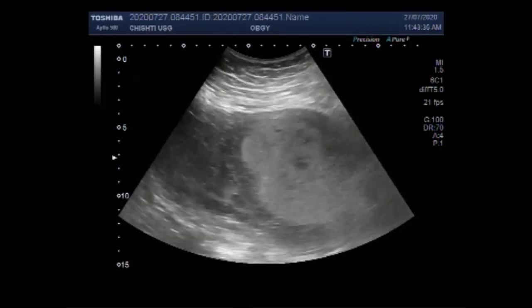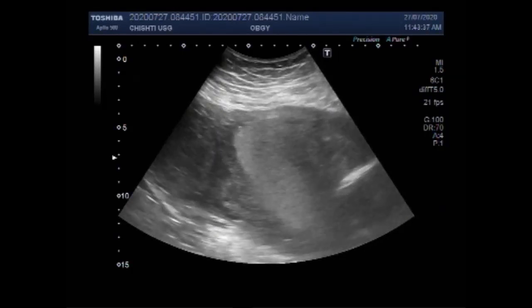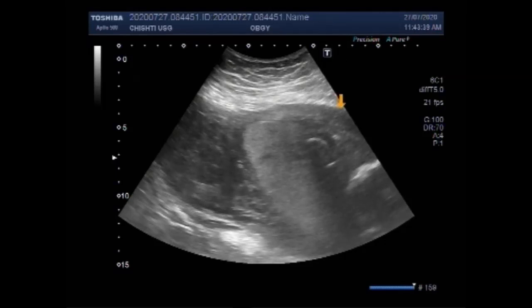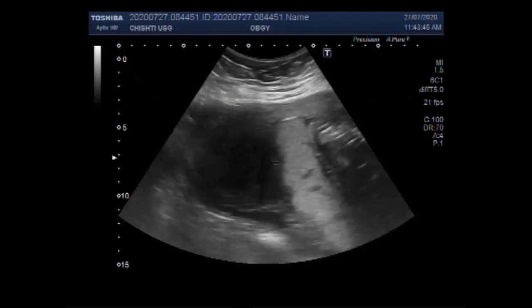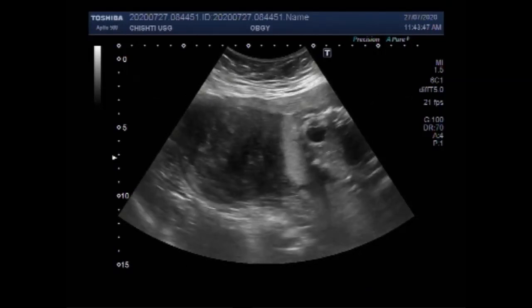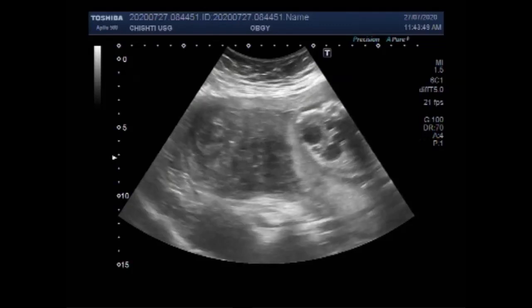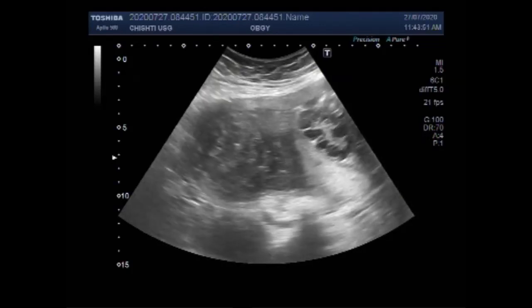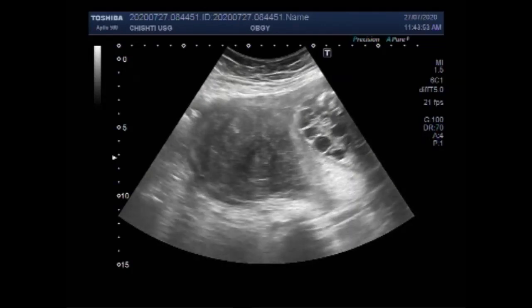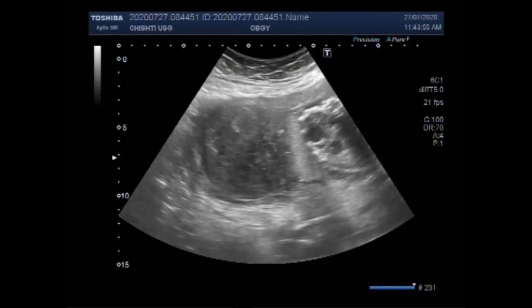You can see the placenta and the mass in the uterus. This is the placenta, and this is the mass — quite a large mass. This is the uterine mass and it measures about 6.9 cm x 6.8 cm.